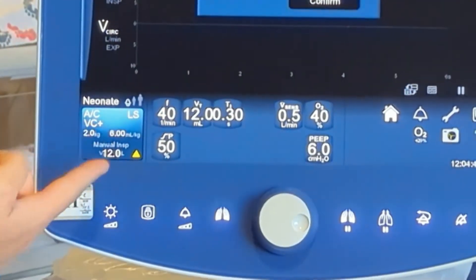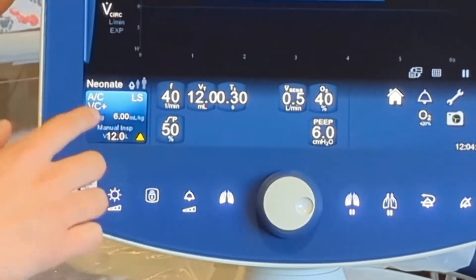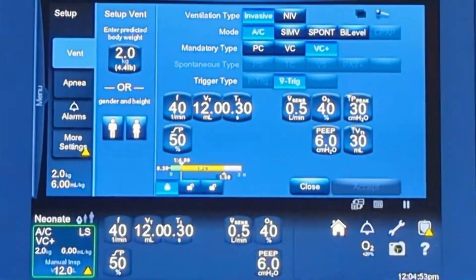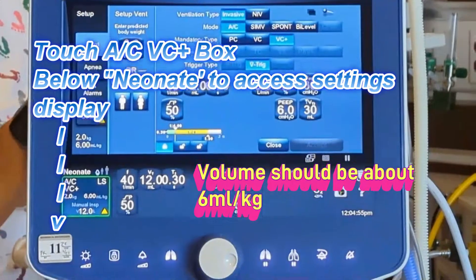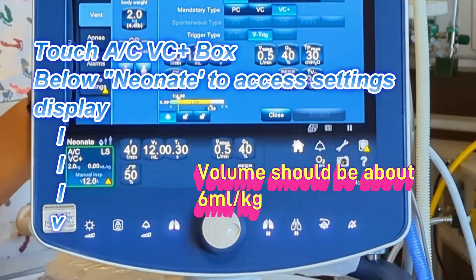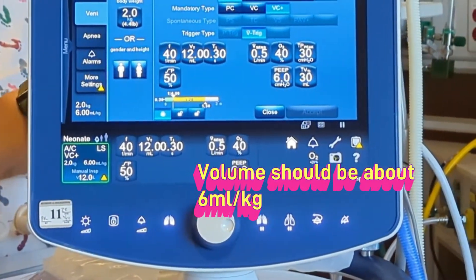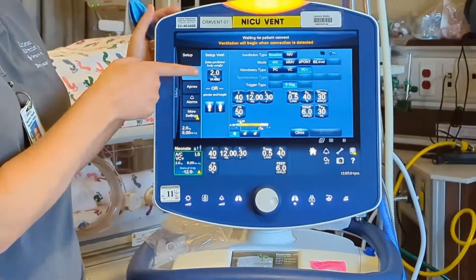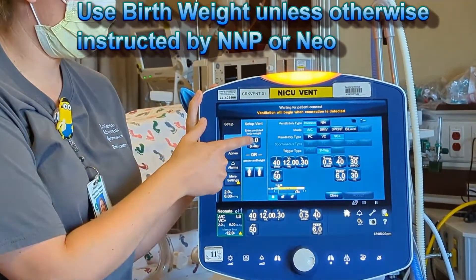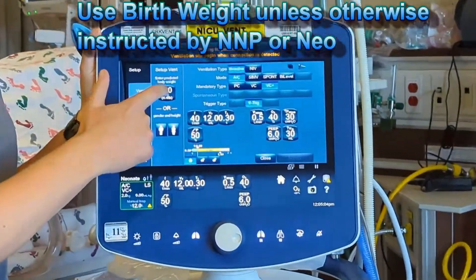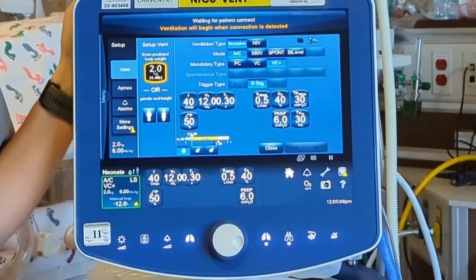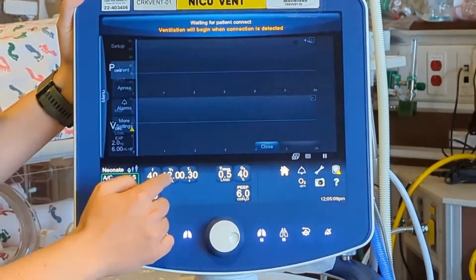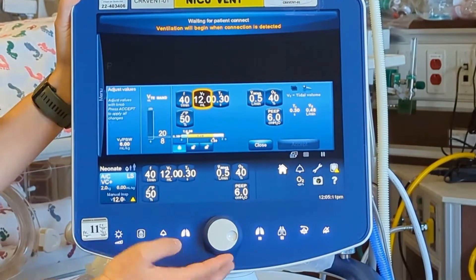Let me take a step back. When we're setting up this ventilator with a baby, we want to ventilate them at 6 mL per kg — that is a lung protective strategy. To make it easy, we're just going to input the baby's weight up here. We'll say they're 2 kg, so 2 times 6 gives us a tidal volume of 12 mL.